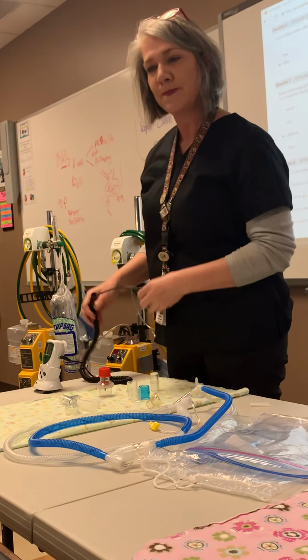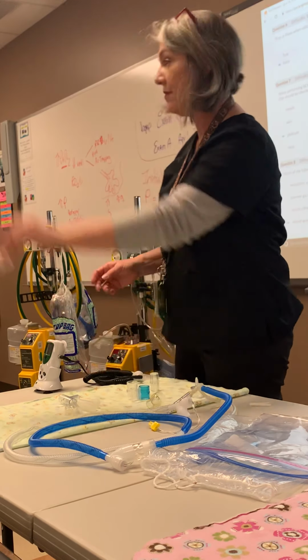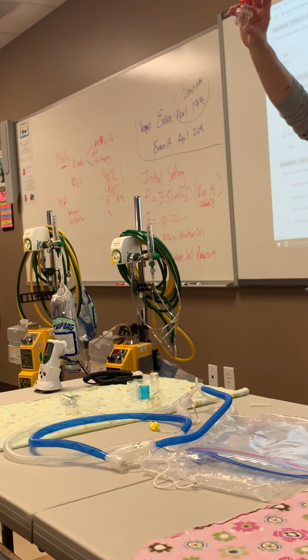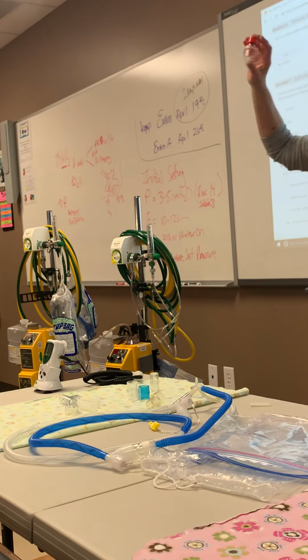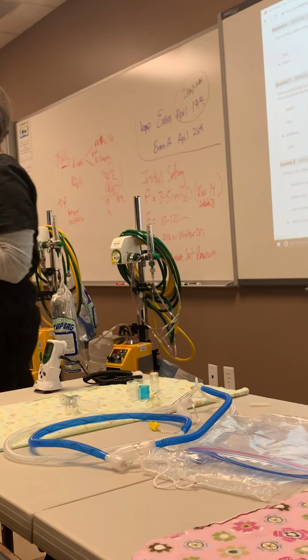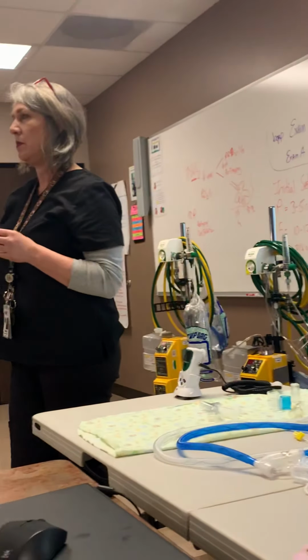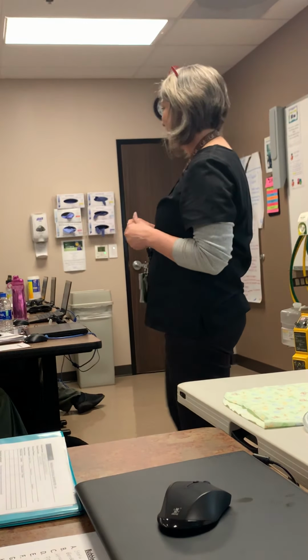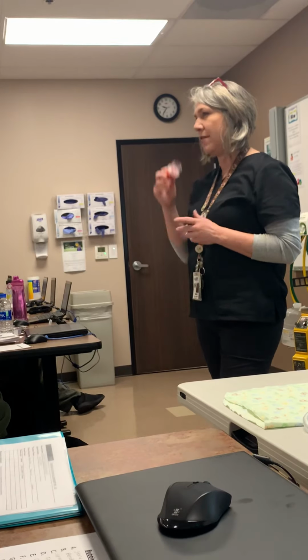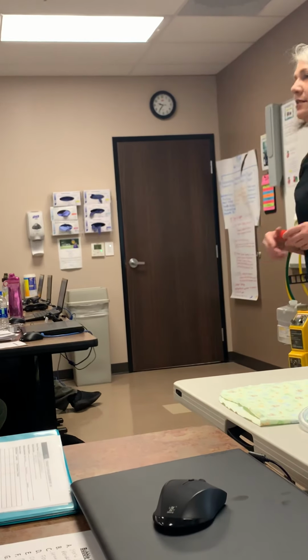Okay, next is your pop-off valve. Pop-off. So, looks like a PEEP valve, right? I would prefer you not use PEEP valve. I want you to use pop-off. It's why I didn't give it to you last week as an option, pop-off or PEEP. I want you to use it as a pop-off. It is a PEEP valve, but in this system, it's used as a pop-off. So it's kind of the one high pressure sensor that you have on this non-electronic device.